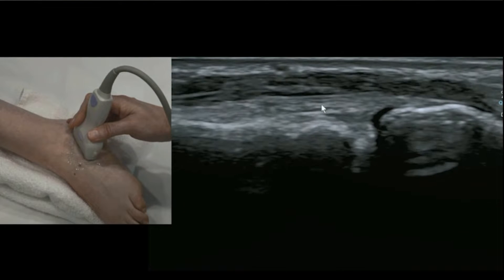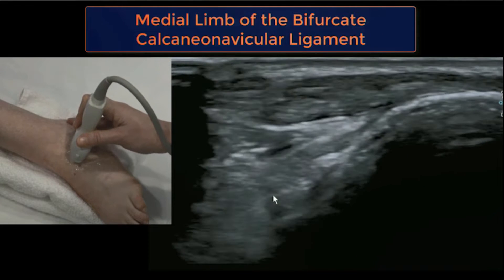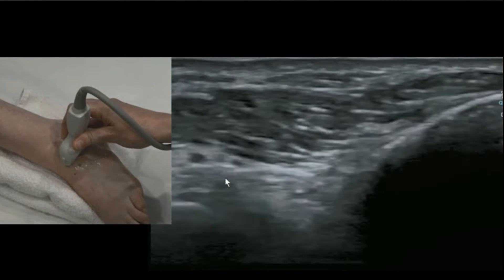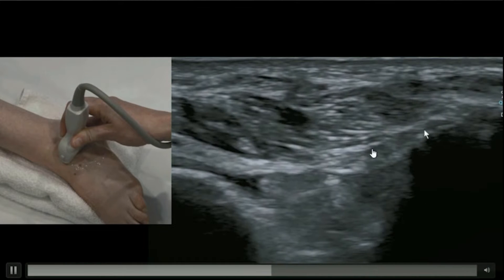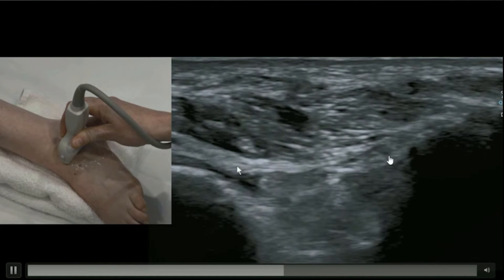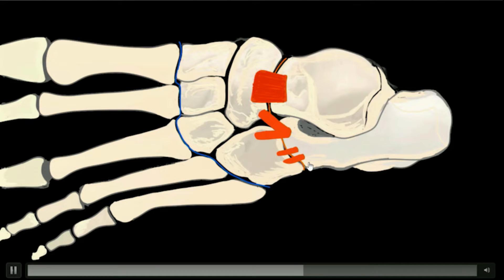Now pivot the probe on the anterior process of the calcaneus and rotate one end of the transducer medially towards the navicular. This gives essentially a cross-section view of extensor digitorum brevis, with EDB as the muscle on top. If you look on the deep aspect of that muscle you might appreciate a white echogenic line spread like a hammock over this osseous valley — the anterior process of the calcaneus on the right and the navicular on the left. It may help to look for a little tiny artery on the deep side of EDB; the ligament sits just under that.